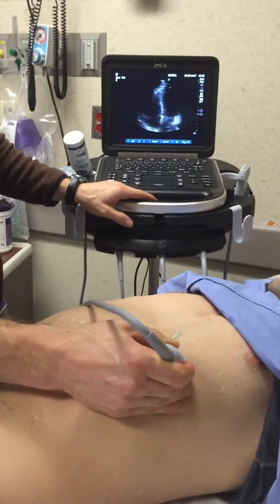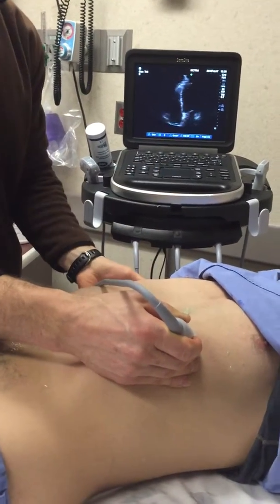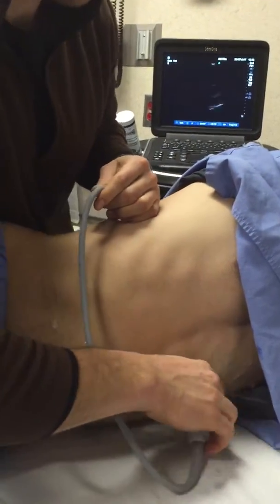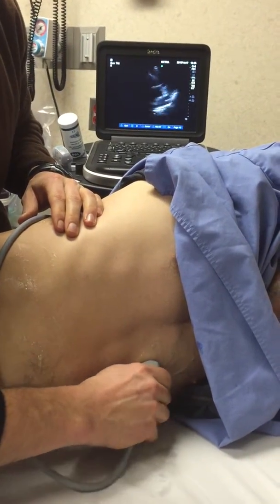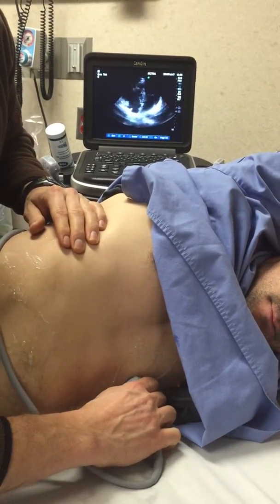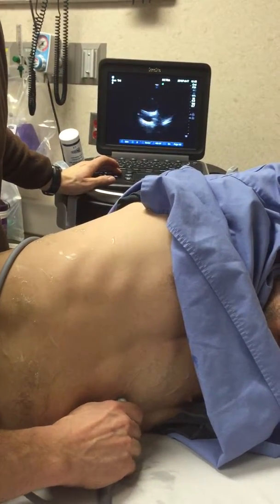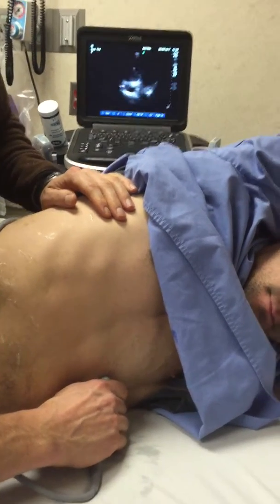If you're struggling with this view, then you can have the patient roll on their left-hand side. And sometimes it gives you a different angle to come and sit right on the rib and angle towards the sternum. And so that's another approach. You can adjust your depth as well, depending. So it's another way. The last view is the subxiphoid view.